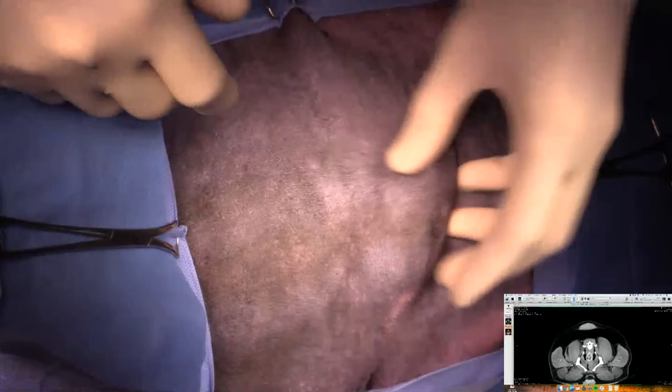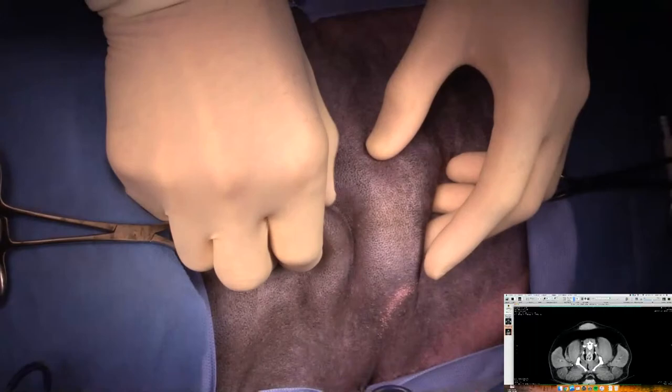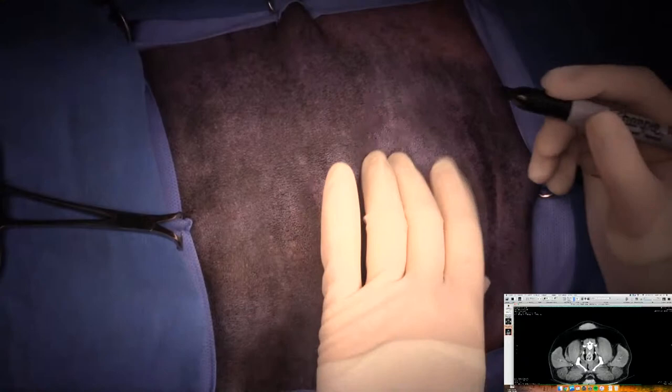The nice thing about this area, particularly in a basset hound, is that we have a lot of extra skin here, which means we should not have any issue with primary closure. This is almost identical to the area that you would take a deep circumflex iliac dorsal branch flap from. So that means that we do have lots of extra skin left over. So first thing we're gonna do is mark the skin where the tumor is, and then we'll measure 3 centimeters out from that as our skin margin.